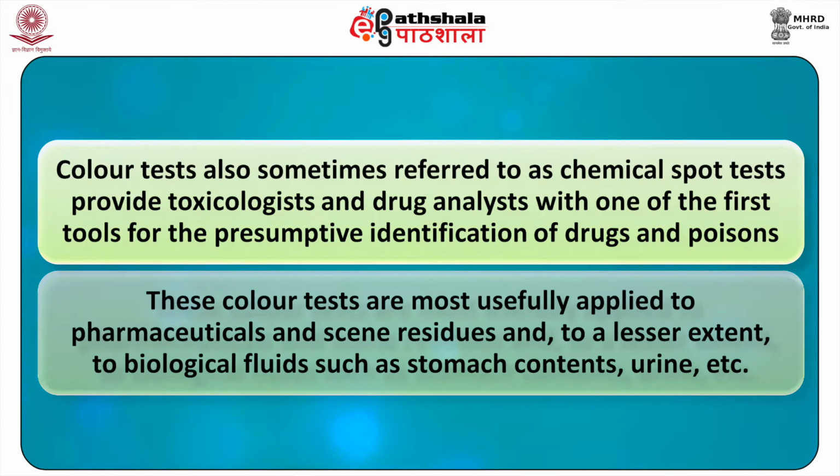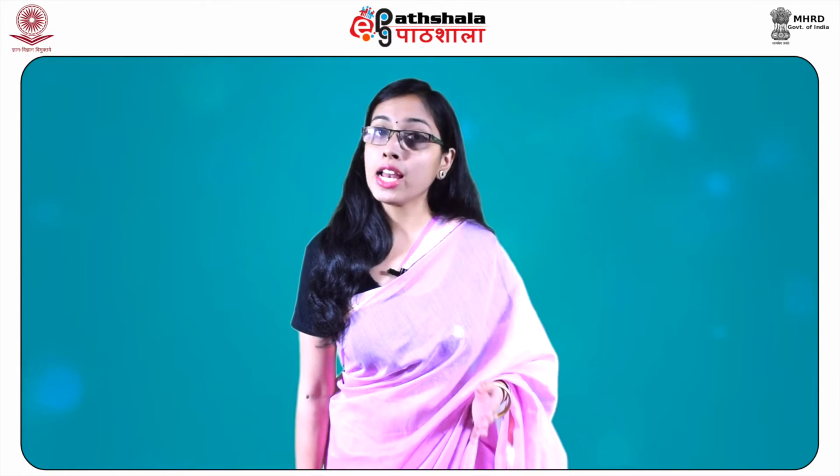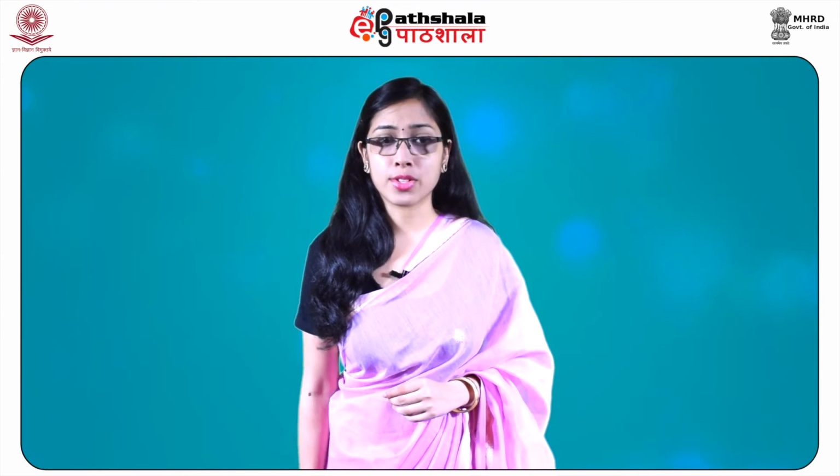The color test, also sometimes referred to as the chemical spot test, provides toxicologists and drug analysts with one of the first tools for the presumptive identification of drugs and poisons. These color tests are most usefully applied to pharmaceuticals and scene residues and to a lesser extent to biological fluids such as stomach contents, urine, etc. They are used to place the unknown into a specific class of compounds or to eliminate the categories or classes of compounds. These color tests remain popular for many reasons.